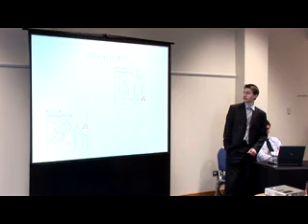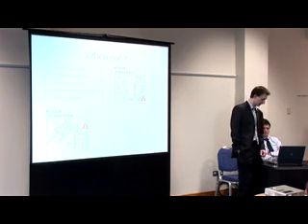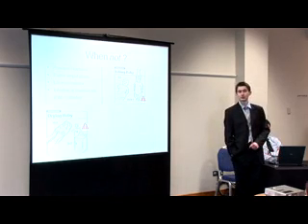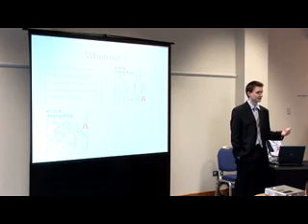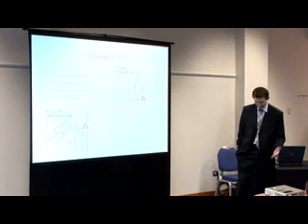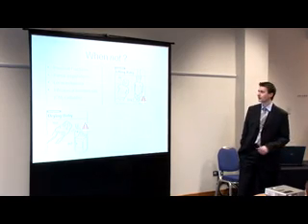Okay, so when not to do it. Here's a couple of things not to do. Here's when not to do IO access, or not to use an IO needle. In patients who've got a fracture proximal to the bone that you're putting it in, okay, if you're going in the distal tibia and you've got a proximal tibial fracture, then don't do it.